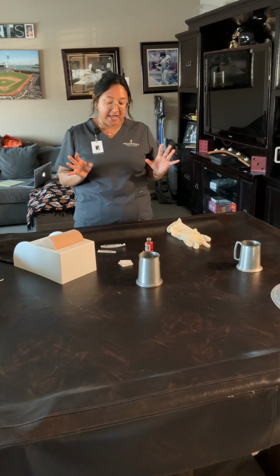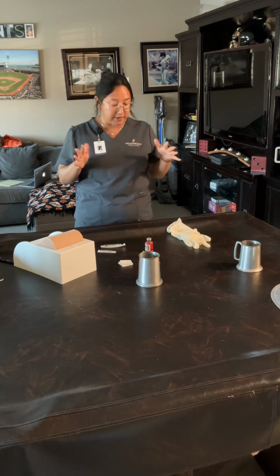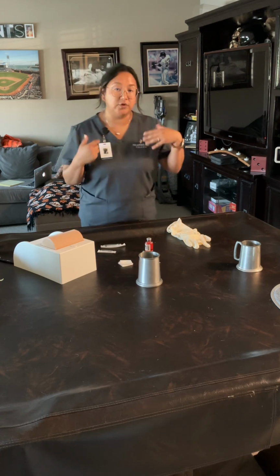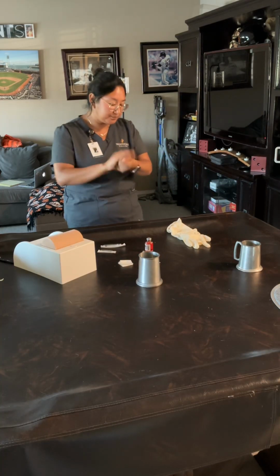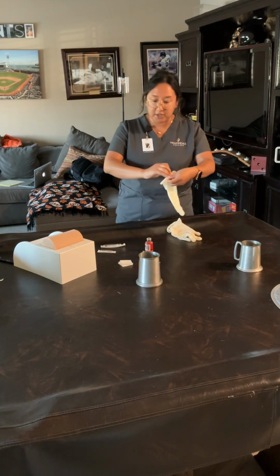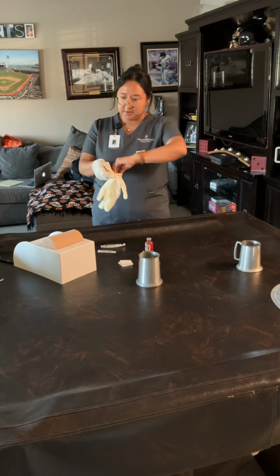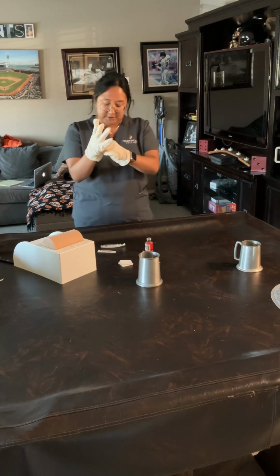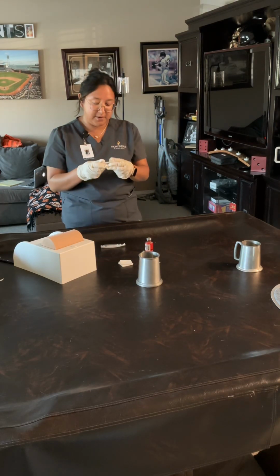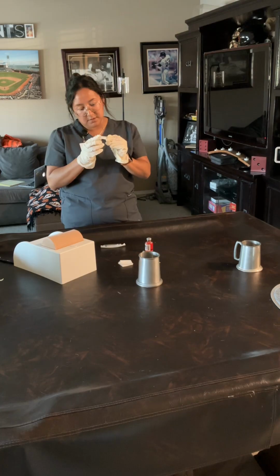Go ahead and verify that, and I'll let them know that I'll be administering morphine, which is for pain, but we'll go ahead and get to that in a little bit. Next, I will get started and perform hand hygiene here. Go ahead and put my gloves on. There we go. Okay, so I will go ahead and open up my syringe here. There we go.